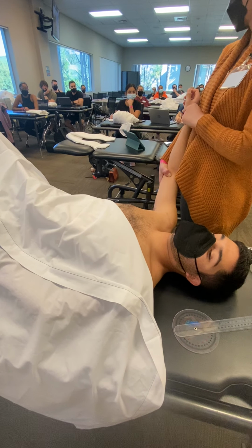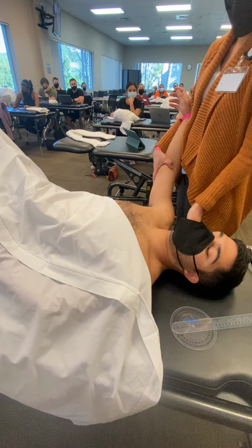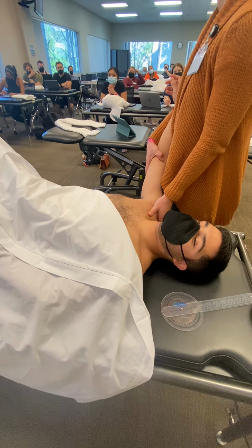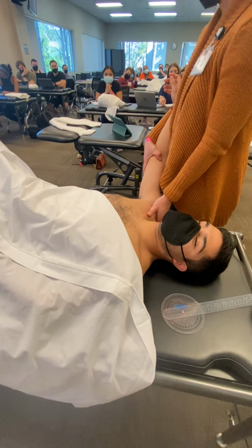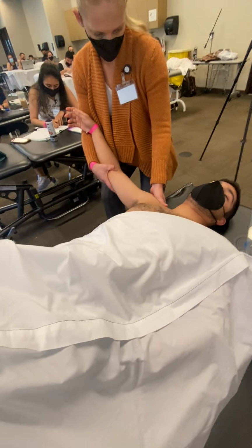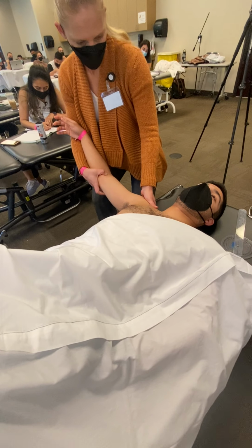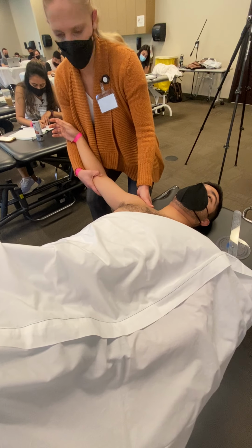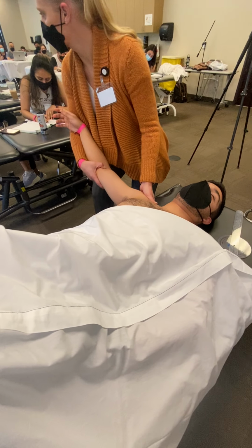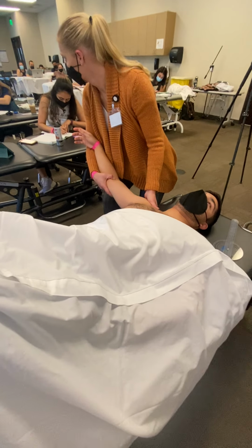I think we covered most of that. So keeping them into external rotation, abducted to 90 degrees, I'm doing the clavicular portion. And then coming down towards the table. You okay? Yeah, I'm good. Breathe. I would be testing the unaffected side first before the affected side. I'm starting to feel that pull.